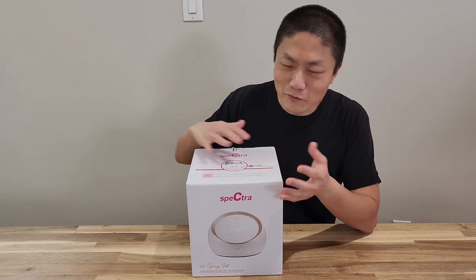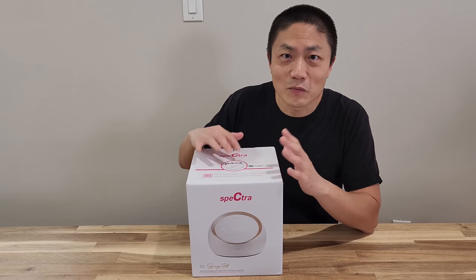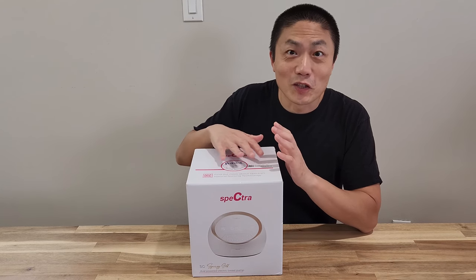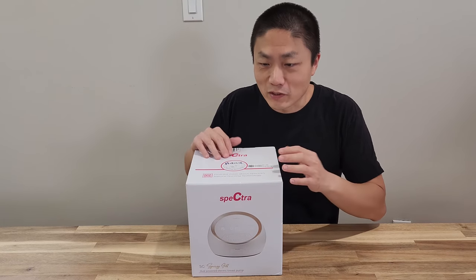I know I'm not supposed to — it's supposed to be my wife who's unboxing this, but she's going into labor right now with our second kid. So I'm just going to go ahead and do the unboxing part, and then she's going to try it out once the baby is home.